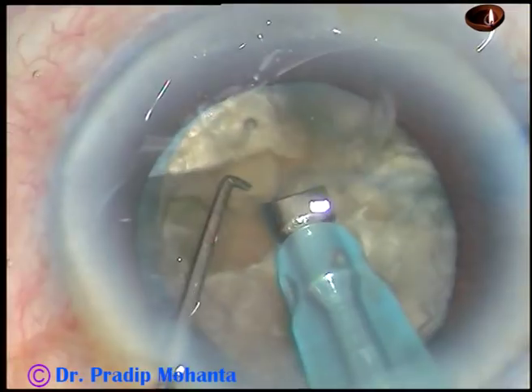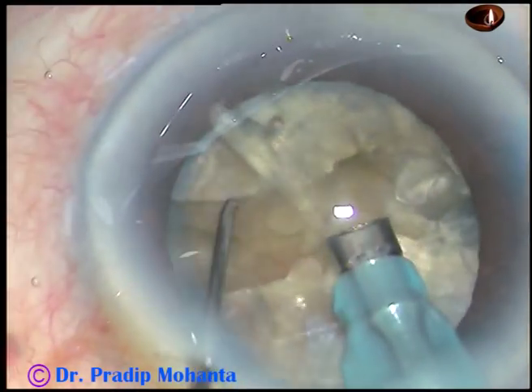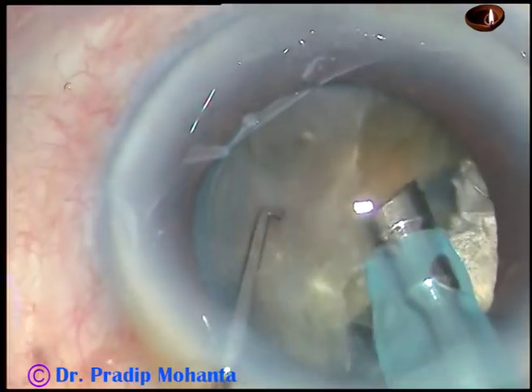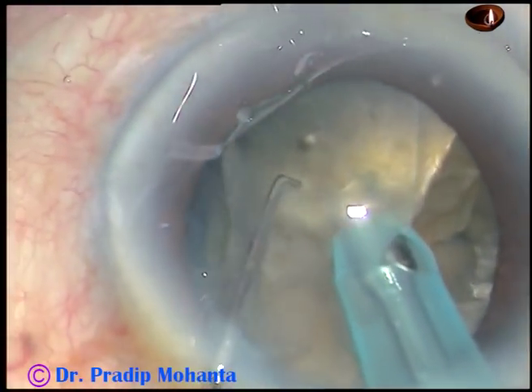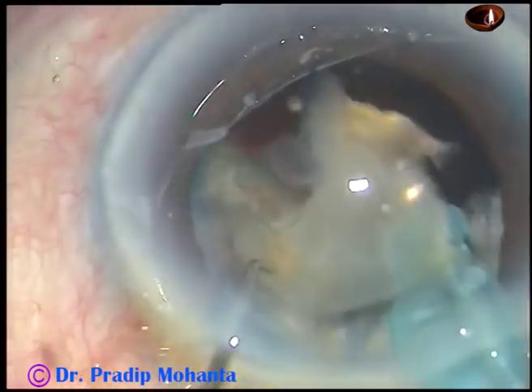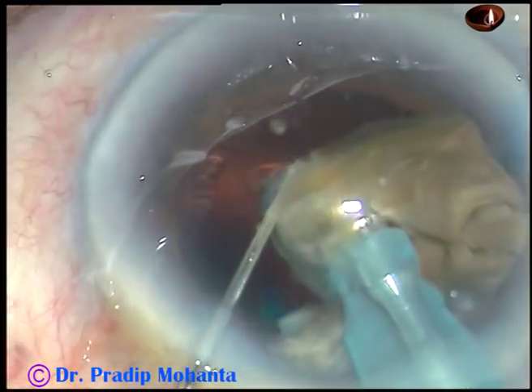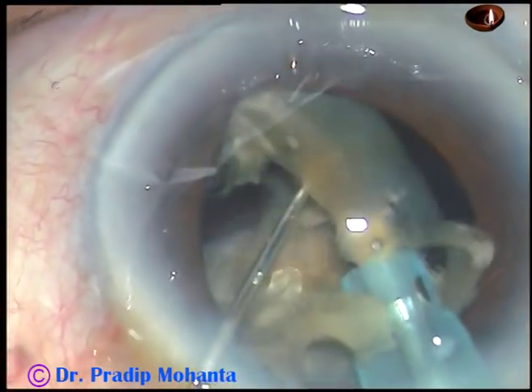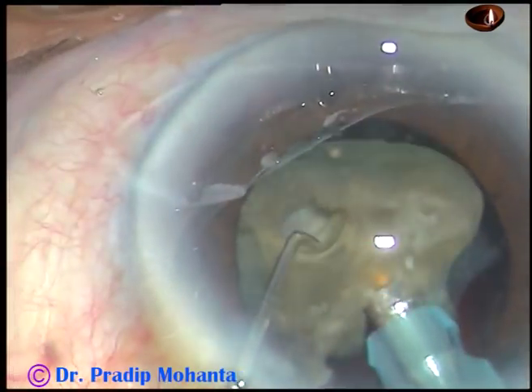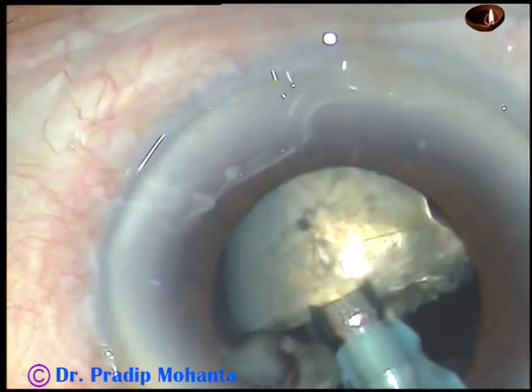Now I am trying to chop this hemi-nucleus, and here I could do it. This free nuclear fragment is being emulsified and removed. Now I am trying to chop this bigger hemi-nucleus and here it is. You can see that the nuclear fragments — the small pieces — are not moving around in the anterior chamber; they stay just around the phaco tip all the time. I am right at the center, at the iris plane, at the plane of the anterior capsule.